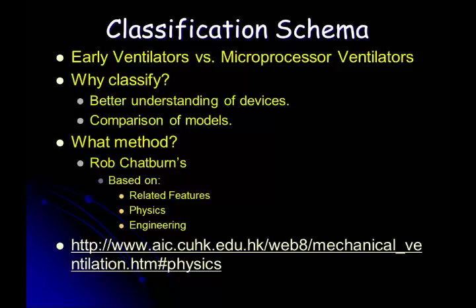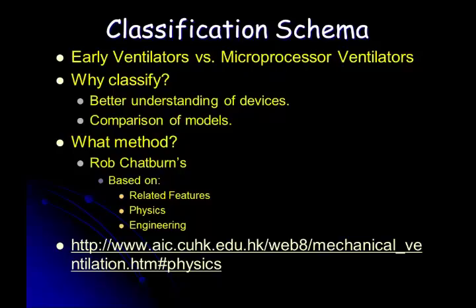Early ventilators could only do one thing. They were either a pressure generator, a flow generator, or a volume generator. New ventilators, because they're microprocessor-based, can be anything. I can be a pressure generator, flow generator, volume generator, time generator, just by a software change.